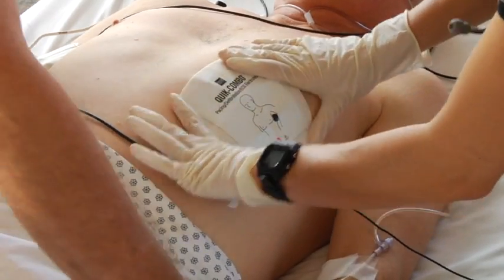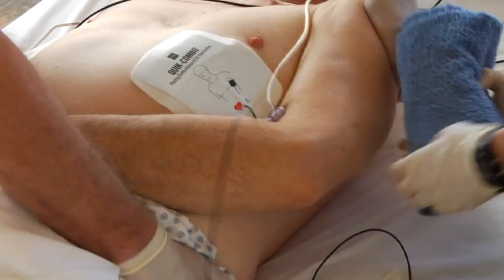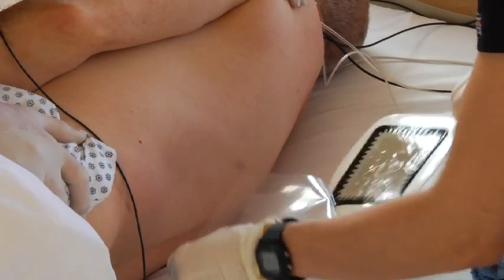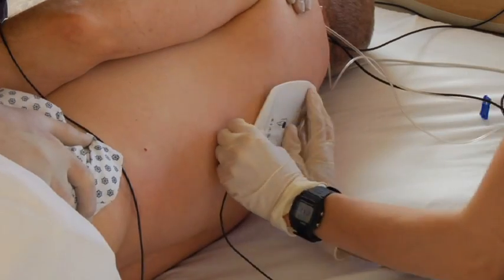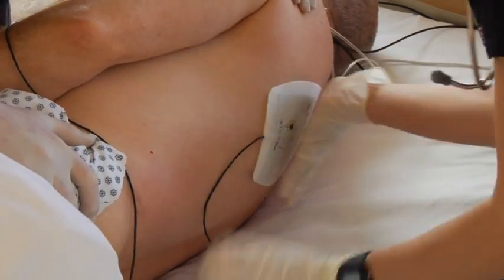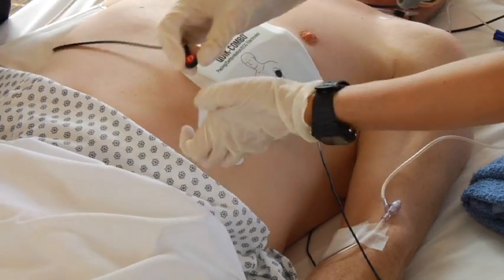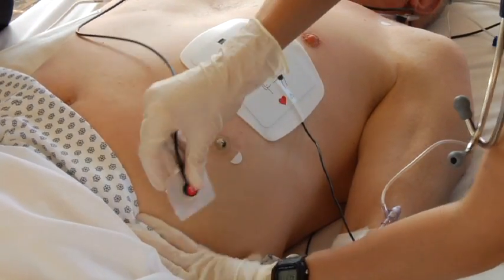If the electrodes are reversed, it might require a higher current to achieve capture. Place the other electrode on the patient's back in the infrascapular area. Be careful to keep adequate separation between the ECG electrodes and the therapy electrodes to minimize artifact on the ECG.